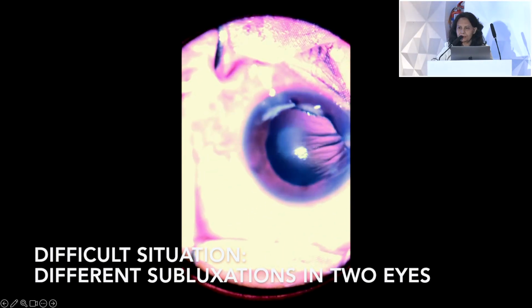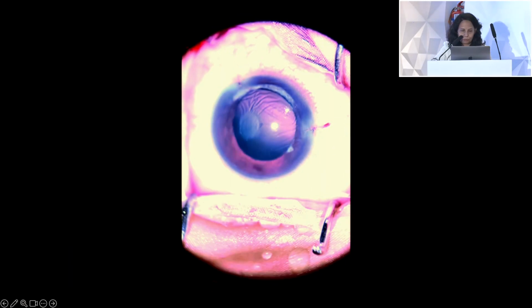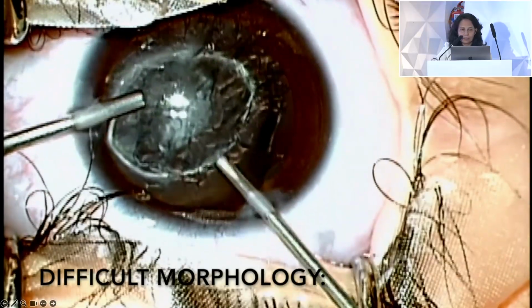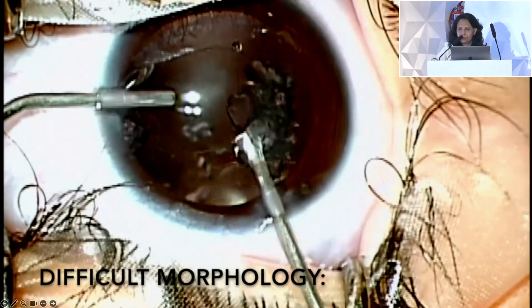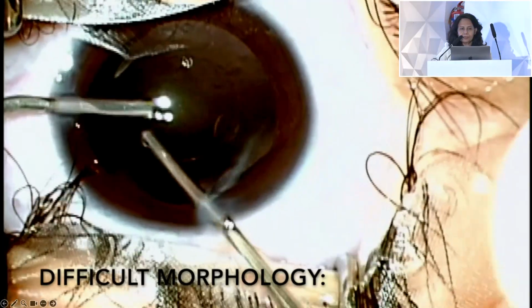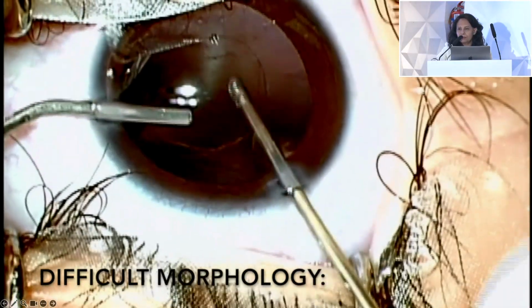This was the anterior subluxated case, and with the vitrectomy cutter, it's very easy to do everything. And the third video that I'm going to show is the difficult morphology. Sometimes there is a posterior lenticonus and a large posterior subcapsular defect. In these situations also you can manage everything nicely with the bimanual vitrectomy.